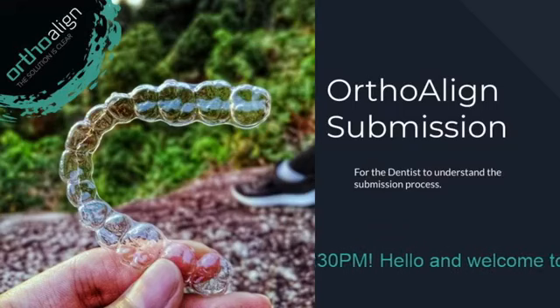Okay, and then the next thing is the RX form. The RX form is going to be important. That is actually where you are going to fill in all of the information of telling what is the situation in the patient currently, what is the patient's chief complaint, and what is the patient, or you as the dentist or the orthodontist, looking to achieve as the final result for the patient.